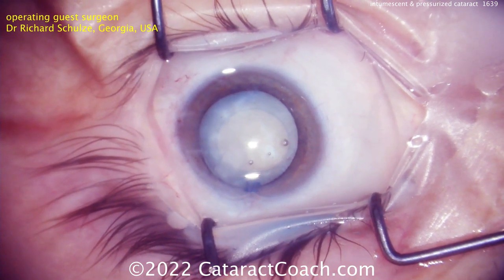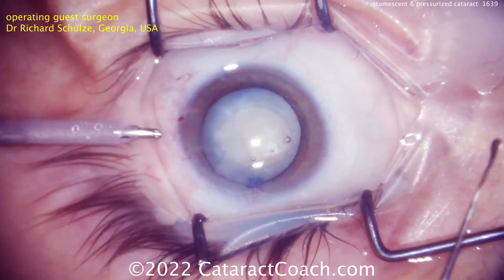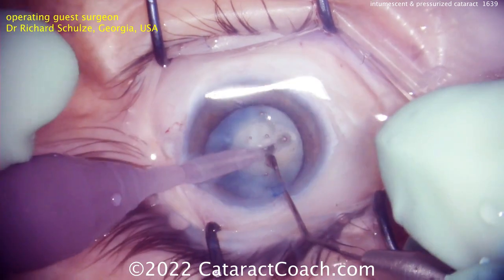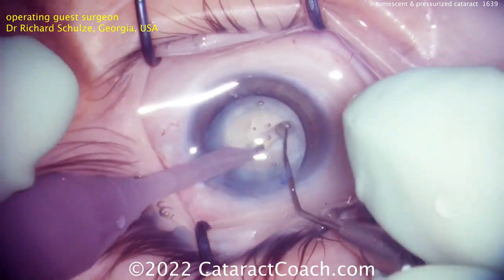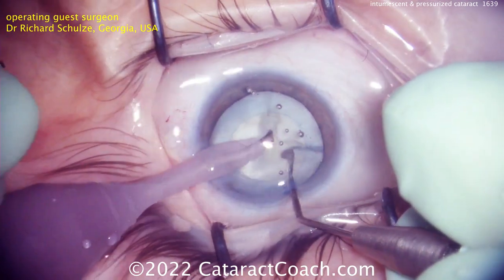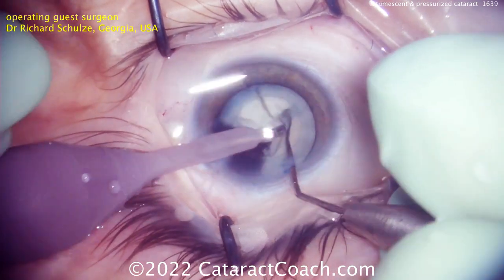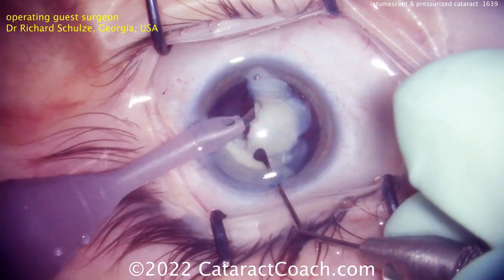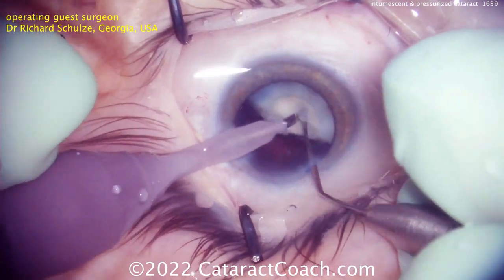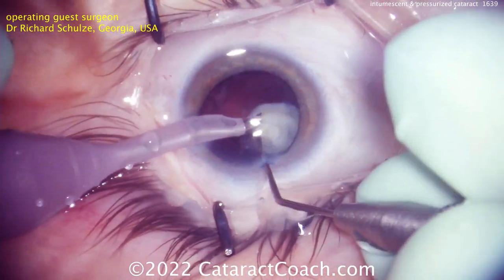This is also a great technique for more routine cases — if you're just starting out and having trouble making a perfect rhexis every time, this device just does it for you. Going in now with the phaco probe, spatula on the other hand — the video is sped up here — groove down the middle, crack and split the nucleus, and removal happens quickly. White cataracts are a favorite because the result is the most miraculous for the patient — this is the closest thing we have to a modern miracle of medicine, restoring 20/20 vision to a patient who was literally blind.